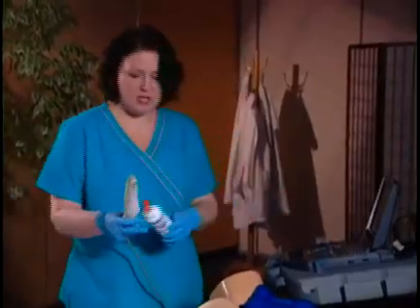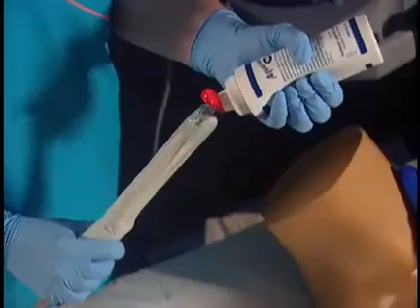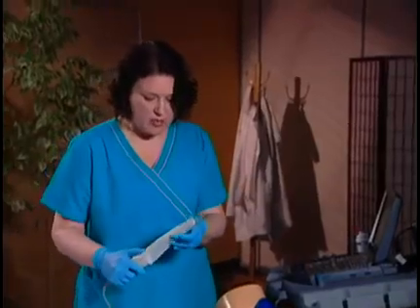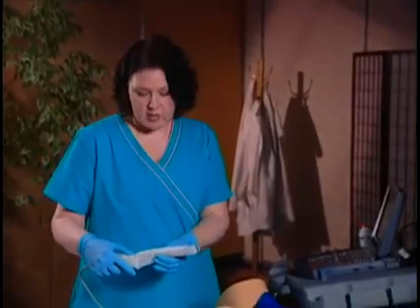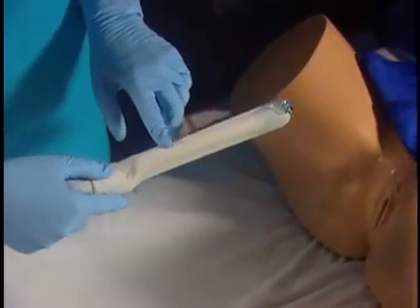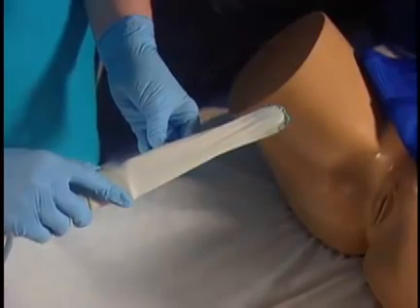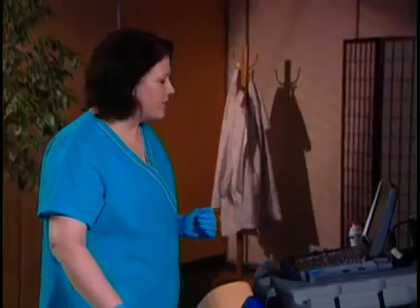We're going to put a little bit of gel on the outside of the latex cover now. And again, your orientation for this examination is very important. For the long axis or sagittal view, we want the orientation marker up. Then when we go to the coronal view, we turn it so it faces the patient's right. After we've inserted the transducer in a long axis view, the first thing we're going to see is a long axis of the uterus.